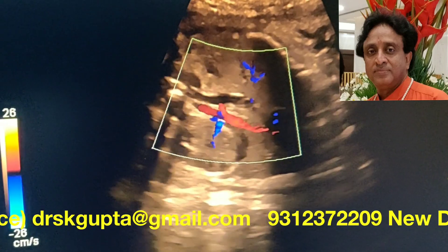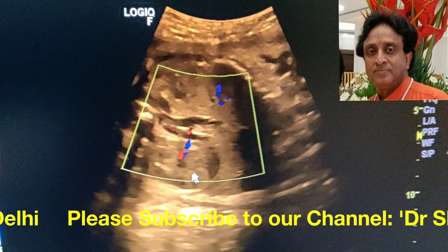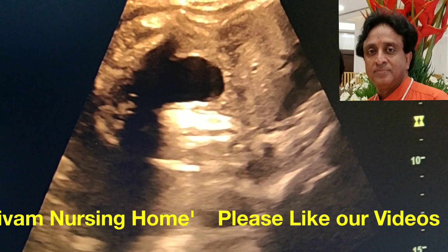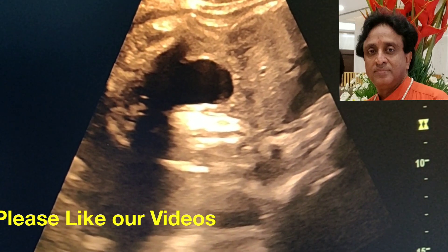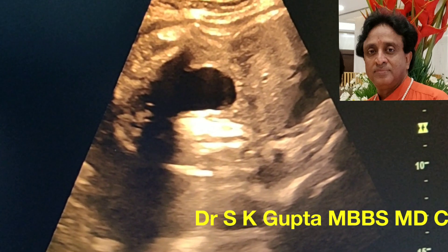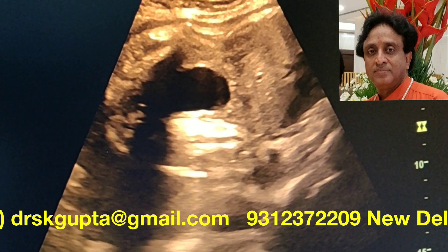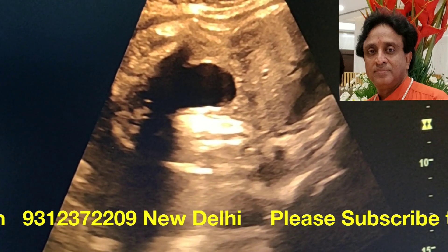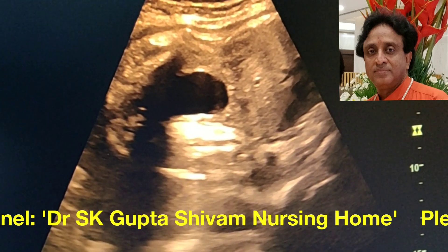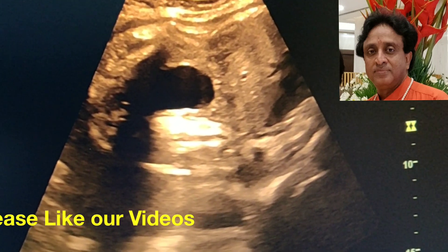We are showing the color flow blood supply to the kidneys. On both sides the blood supply appears normal — both kidneys are taking up normal color. There is no evidence of any renal problem. Sometimes renal dysplasia or renal agenesis may cause oligohydramnios, but in this patient both kidneys are well seen, the bladder is normally filling, and urinary passage through the urethra appears normal as the bladder is being emptied.